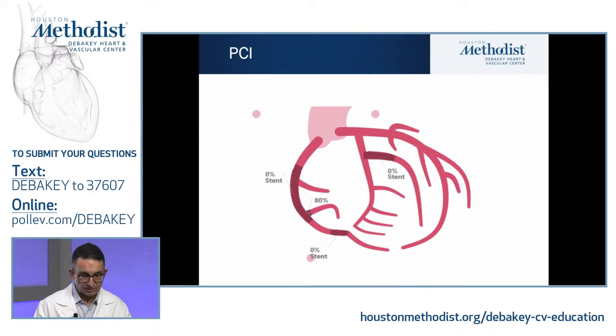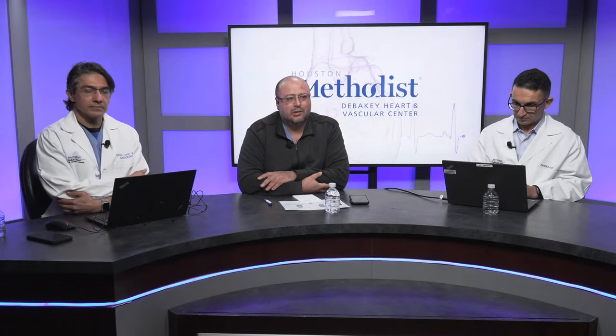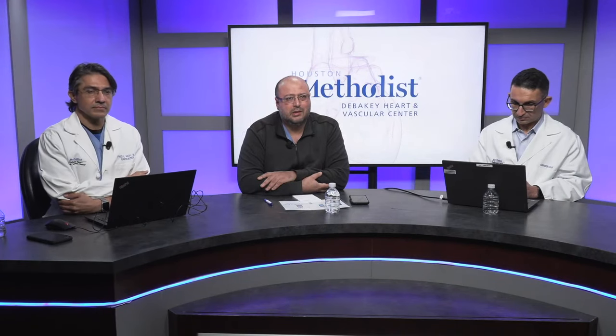Any comments? Yeah, so this is clearly a case where it was clearly identified that the other vessels did not have much stenosis. I think this is the added value of flow here. Although the SPECT imaging, summed images were very diagnostic in this case, and can guide you that there is only single vessel disease in this point.